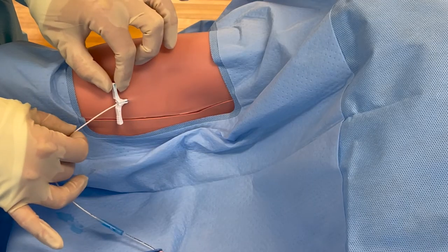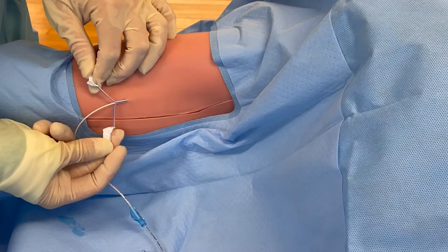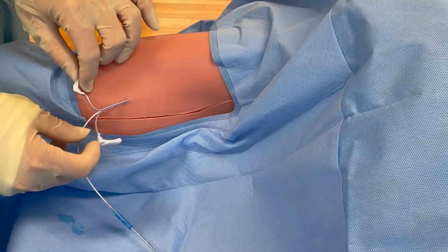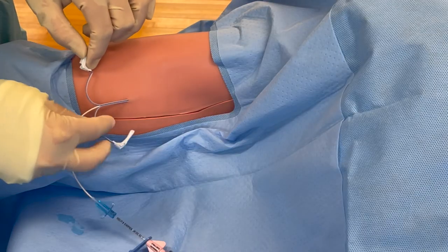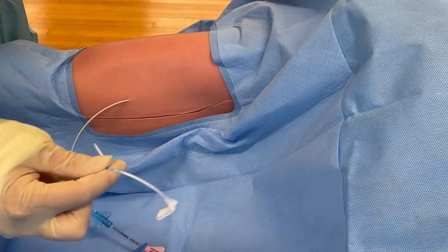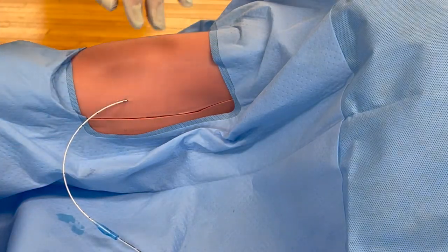Once you have your PICC tip in the correct position - remember there are three textbook locations for that - you would, holding the PICC line where it is, slowly retract the introducer and then it snaps apart and peels. Make sure your PICC line has not migrated out, then pull the introducer over it and peel it apart. Pull and peel, pull and peel, pull and peel it off entirely. That is single use, and ensure you are at 35 centimeters or whatever your tip location was.